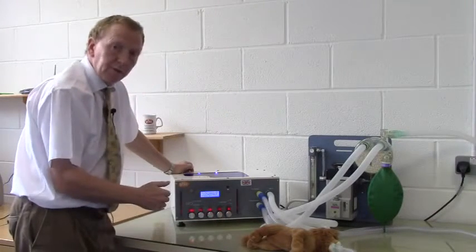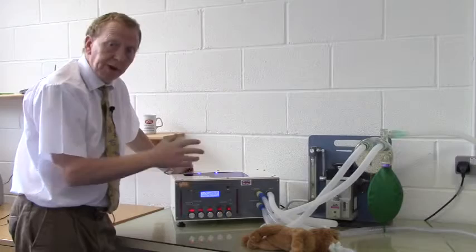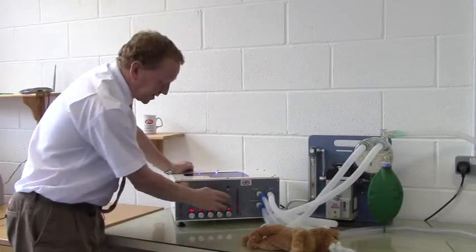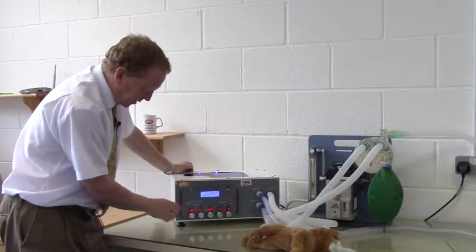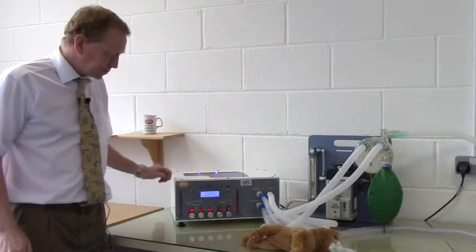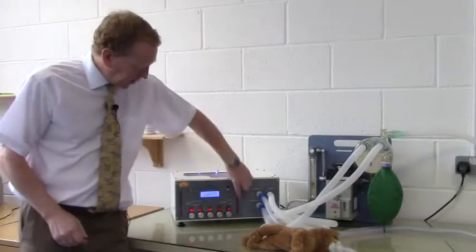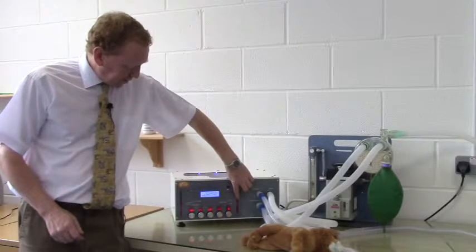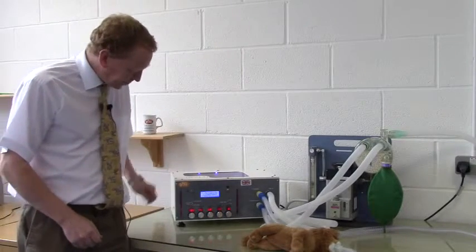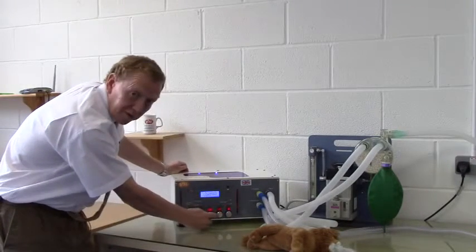So this is our target airway pressure, and if we've made our calculations correct, then we should find that the volume delivered will be about 150 mils, as we had with the previous volume cycling. Again, sigh mode is off. This is in the flow position, and now we hit run. We'll see that Leo's chest is inflating just as before. The airway pressure is getting up to just under 15 here, as we see by the rough guide from the bar graph gauges. And if we look on the screen, we'll confirm that the airway pressure reached is 12, which is what we've set here.